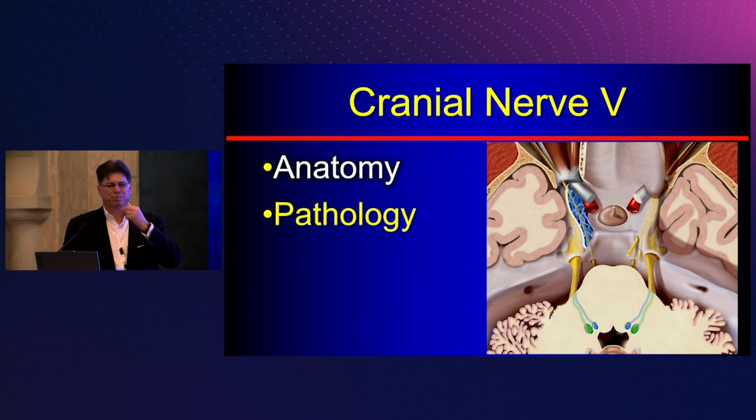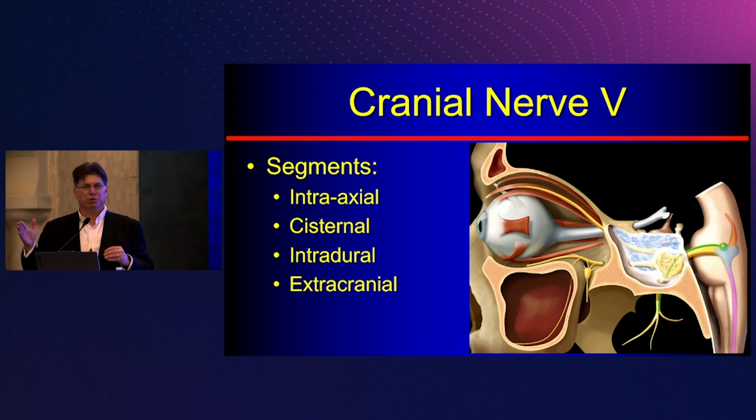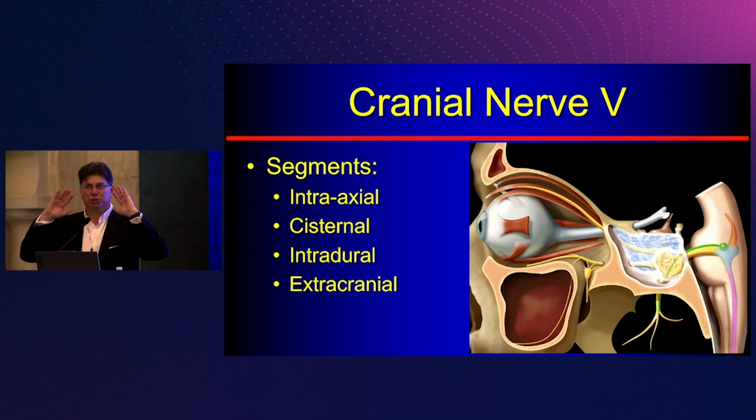the cranial nerve. The idea here: anytime you have an isolated cranial nerve deficit, we want to think about imaging from the origin nucleus all the way out through the end organ. So for most of those, if you start behind the pontomedullary junction and go through the face, you've usually covered the area of interest, especially if you get 5 and 7 confused, and we'll talk about that. Is it pain or is it paralysis?